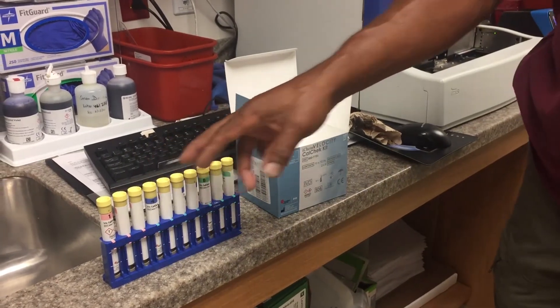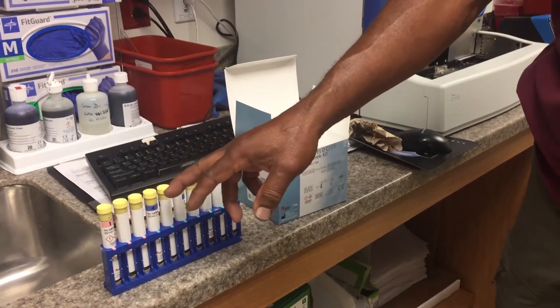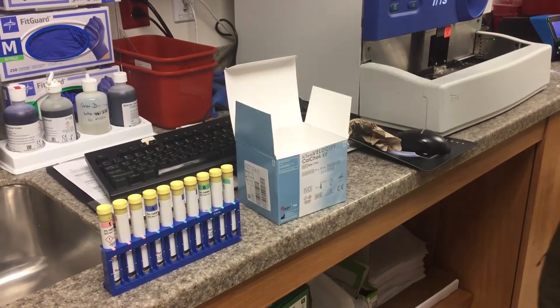You either can mark them — one, two, three, four, five, six, seven, eight, nine, ten — you can mark the cap itself. Or you can put them down in order.